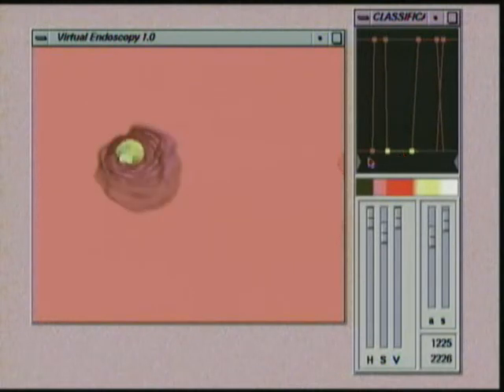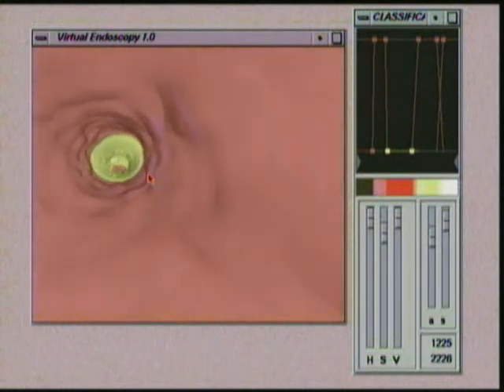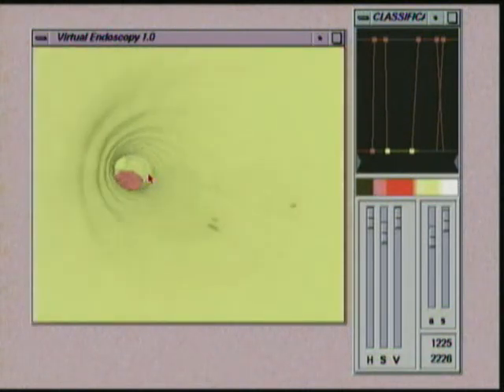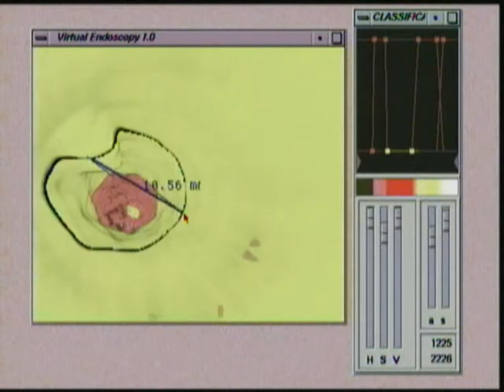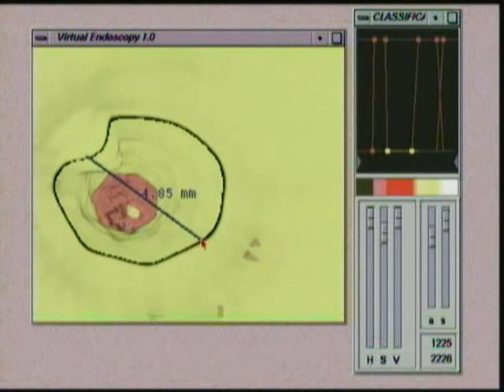We now make the contrast material totally transparent and enter the vessel, traversing it using dynamic camera control until we reach the stented region. Lumen variations are interactively measured using ray casting from the 2D mouse position. A small narrowing associated with the stenosis area is clearly visible.